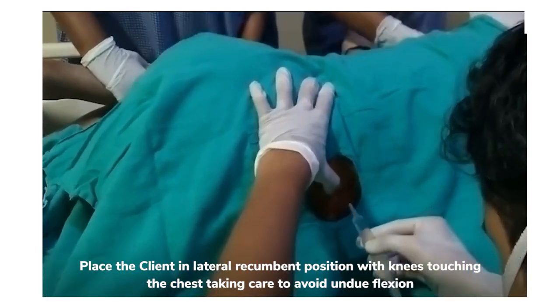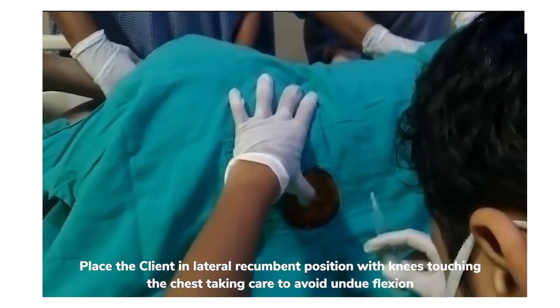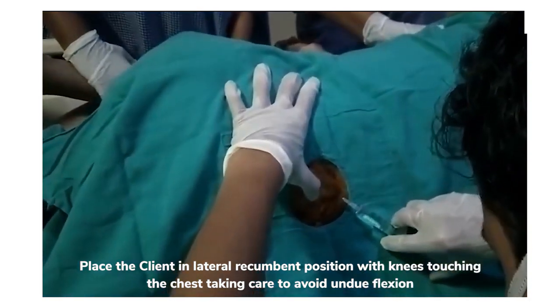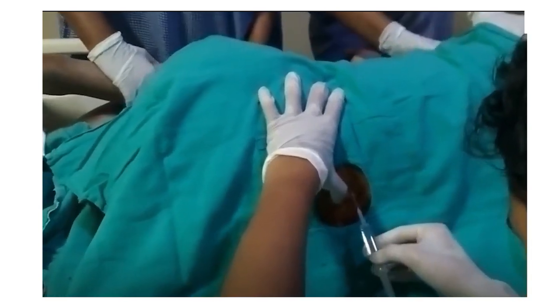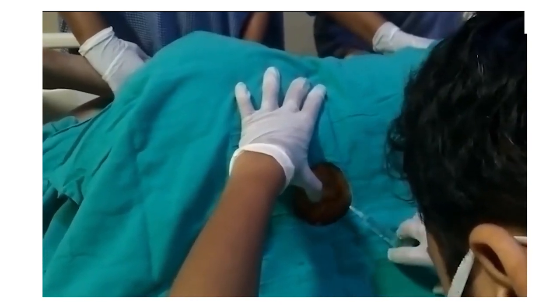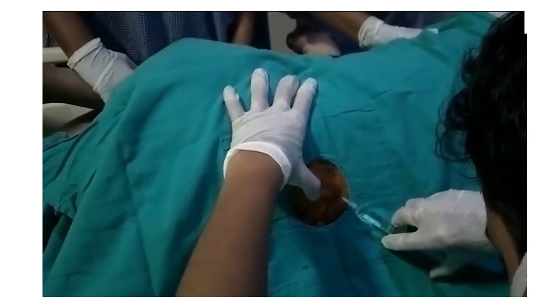You can notice that when you are planning to give local anesthesia to the patient, the simple prick of the needle can make the patient buck and make him uncomfortable. So it's important that somebody should be consoling the patient and supporting the patient emotionally. You can be using a 25G needle initially for producing the skin wheal, and then you can change it to a 20G longer needle for anesthetizing the deeper tissues.